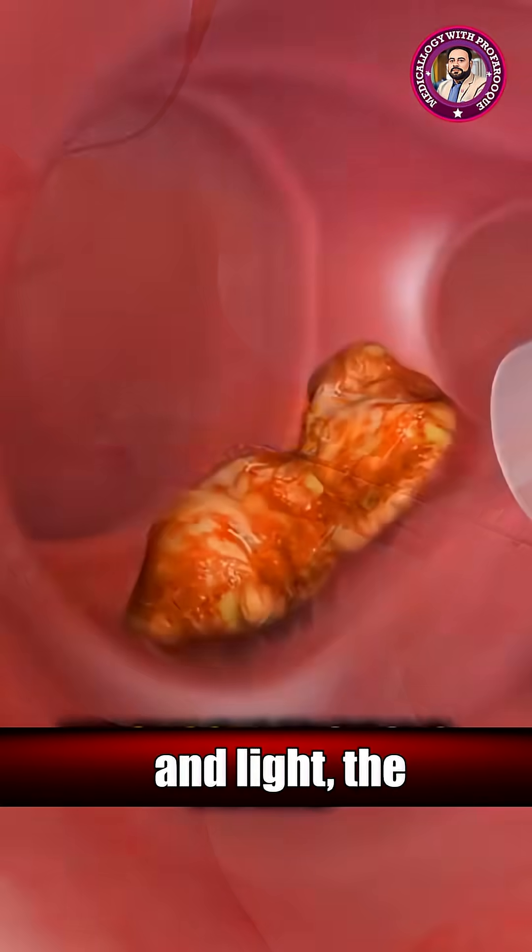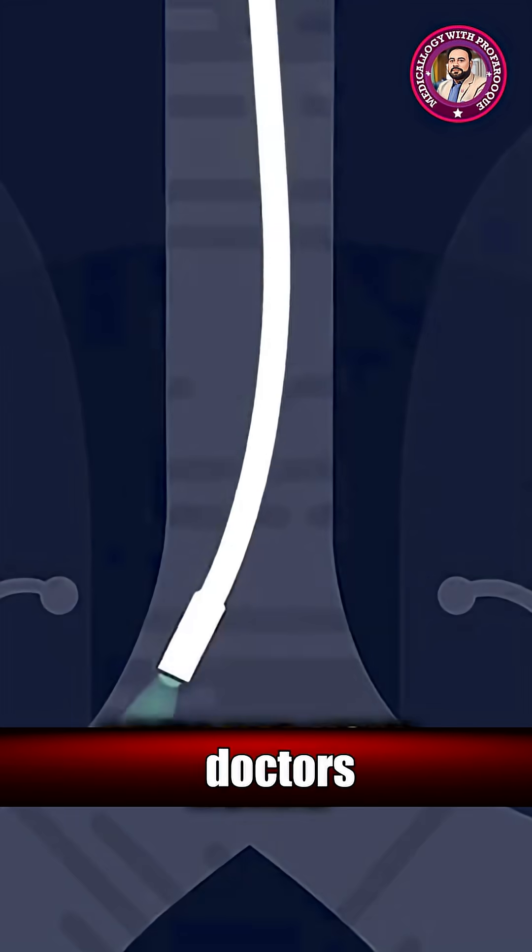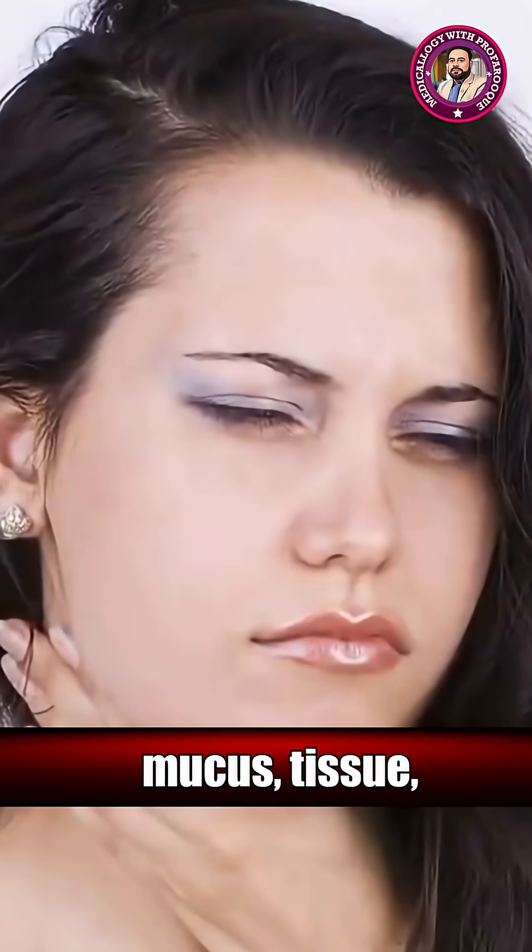Equipped with a tiny camera and light, the bronchoscope provides a detailed view of the airways and helps doctors collect samples like mucus, tissue, or small biopsies when needed.